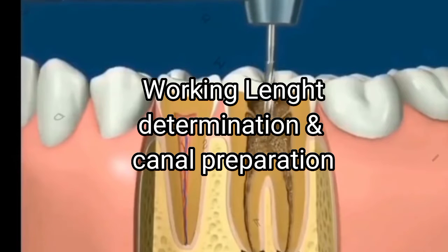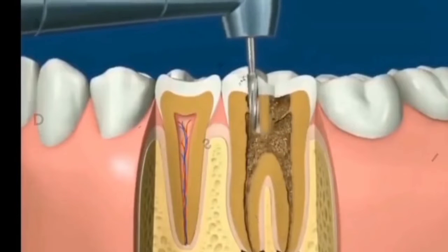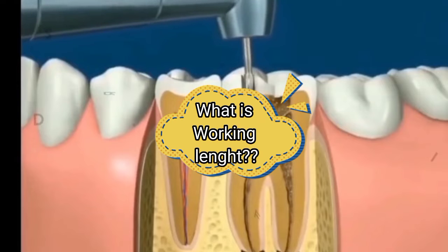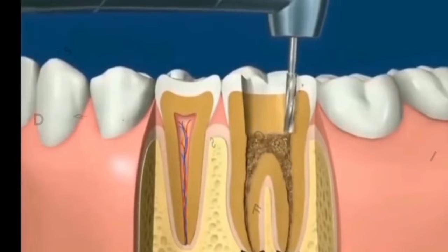In today's video, I will talk about the working length determination and canal preparation. So without any delay, let's jump into it. Now talking about the working length. Basically, working length is the whole length in which we are going to work, right? So working length is that part of the length in which we are going to do RCT.